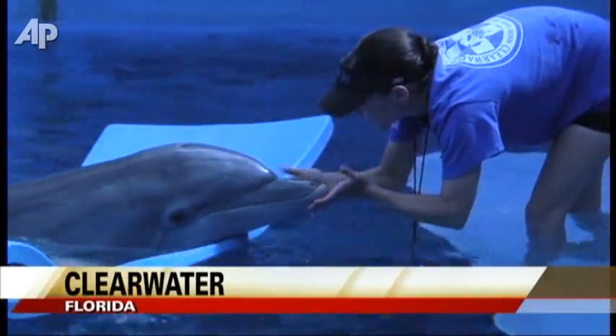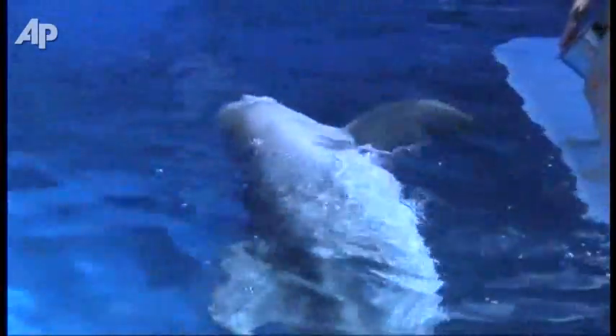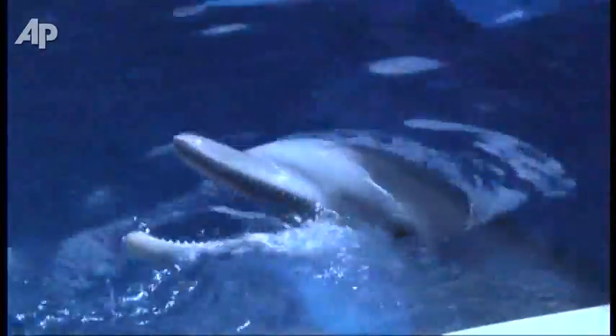This is a very soft gel composite material that's actually called Winter's gel. It's actually called that in the movie Dolphin Tale — it's featured in the movie. This is very soft but also very, very strong. So we put this on first; it protects your skin but also provides suction. The only thing that makes the tail stay on really is suction. Once this is on her body, we'll then put this on.